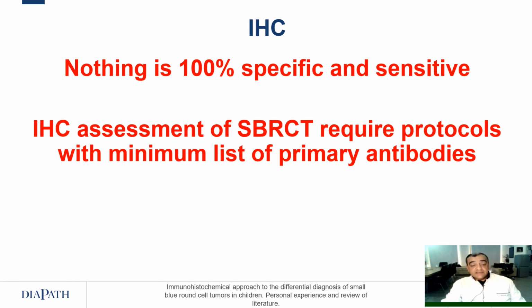And in case of the differential diagnosis of small blue round cell tumors, immunohistochemistry assessment must include a protocol of different antibodies that I have mentioned in my lecture.